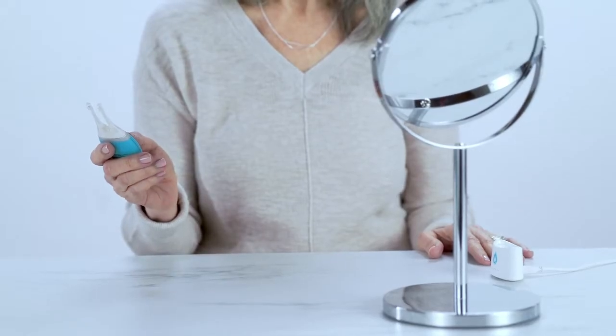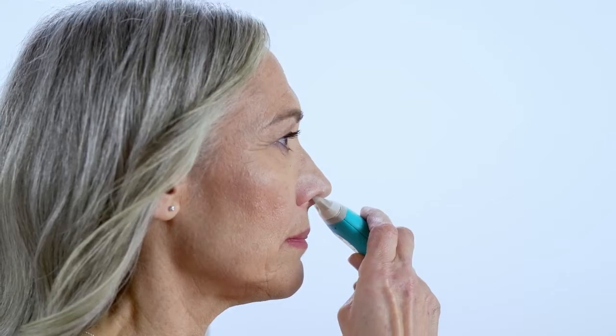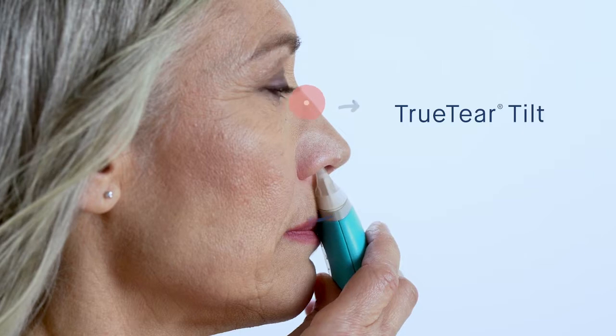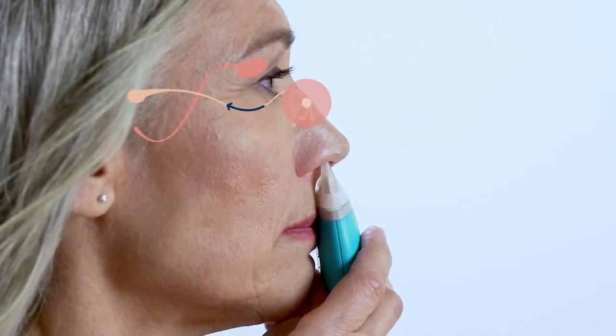Now it's time to use TrueTear. Once the device is on and set to the appropriate level, you will not need to press or hold any additional buttons to start neurostimulation. While looking in a mirror, with the buttons facing your lips, gently guide the tip into your nose toward the bridge, where glasses would normally rest. When the tip is far enough into your nose, it's time to TrueTear Tilt. For effective use, tilt the tip away from your face to ensure the tip is inserted all the way to the top and front of the nose. You should feel a gentle, intermittent pulsing sensation.